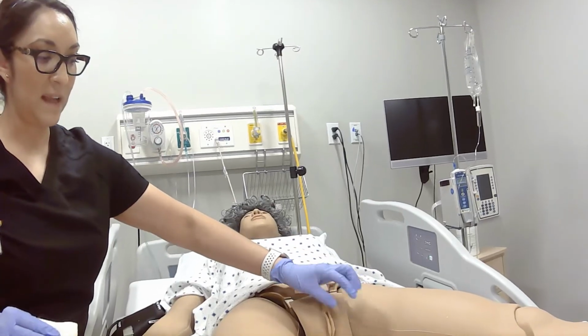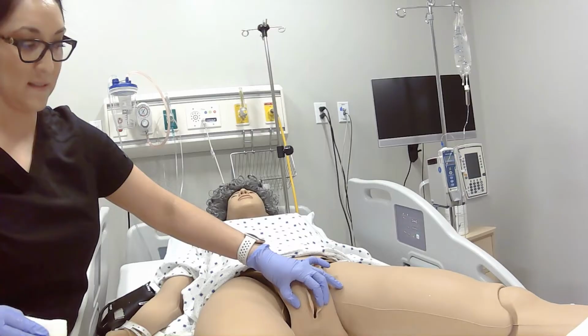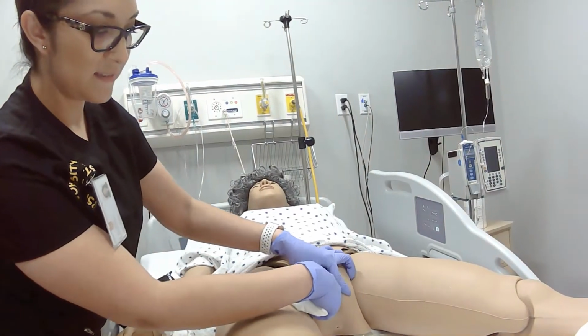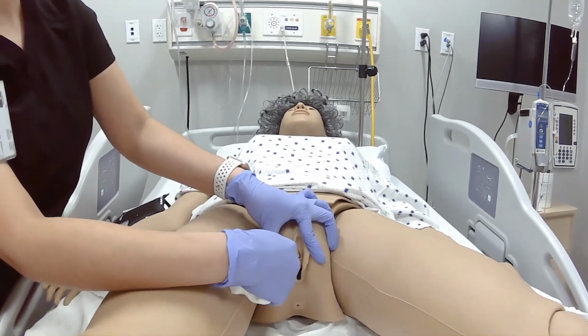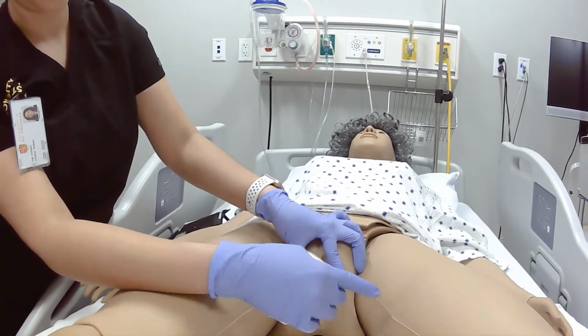So you have the labia minora and the labia majora. The labia minora is inside here, and then the labia majora is external. So we want to get inside the two labia minora because that's where the urethra is, okay? This is the site of insertion where the Foley catheter is going to go in through.